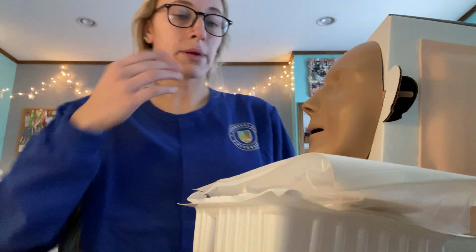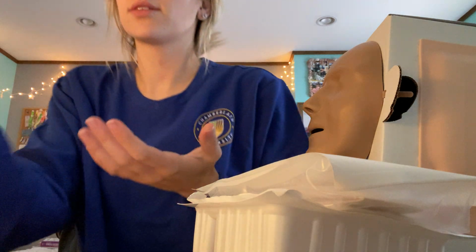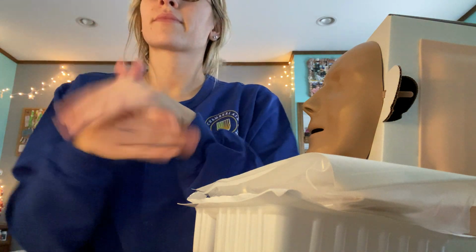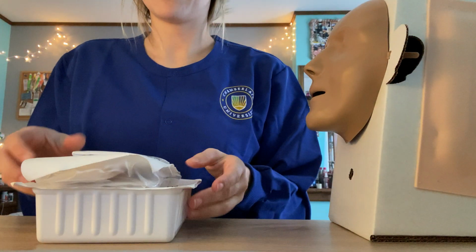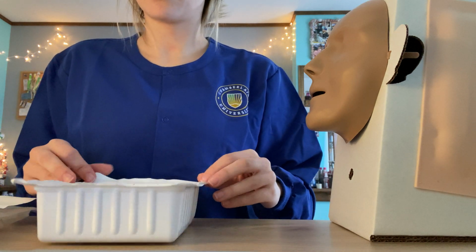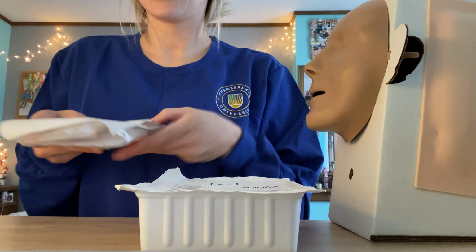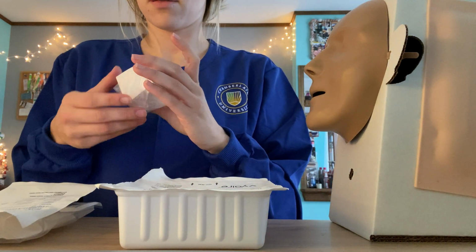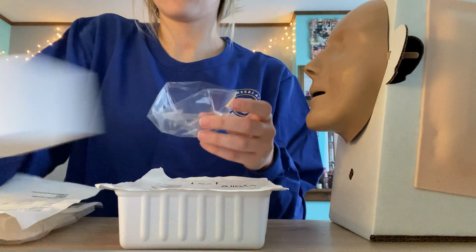Okay, so while I'm getting started, I would do my PPE. I would wear mask, gloves, gown, and then I would do my hand hygiene. I'm getting my supplies prepared here. Let me put this down so you can see more. My supplies are getting prepared. Put my PPE on, mask, gowns, eyewear. Okay, my sterile gloves are right here. My suction kit is right here, and my saline basin is right here. Then I'd pour my sterile saline into this basin right there.